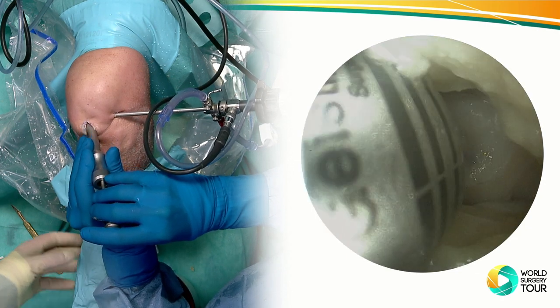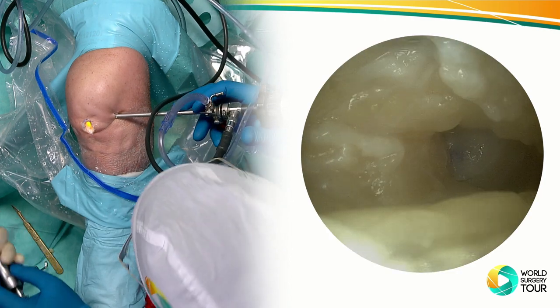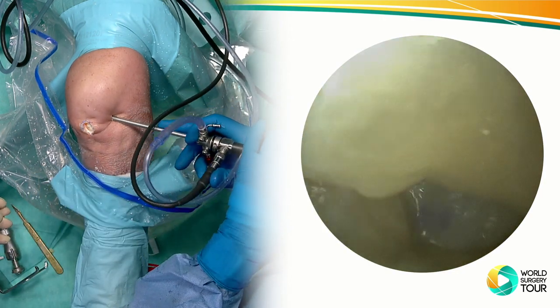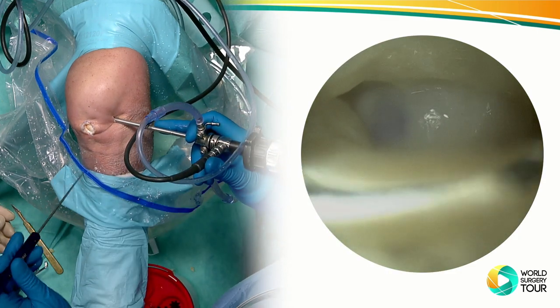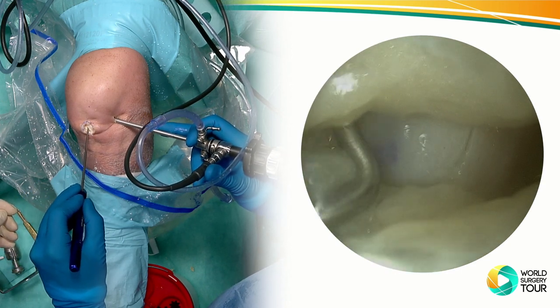Okay, then I had a rasp or something. Do we have a palpation hook? I don't have it. Okay, in a second we're going to apply some water, then it's going to be a little better to see. So now try to... Okay, looks really nice.